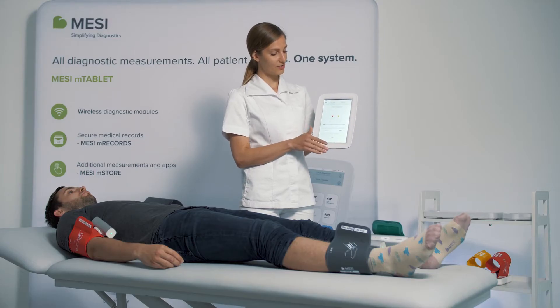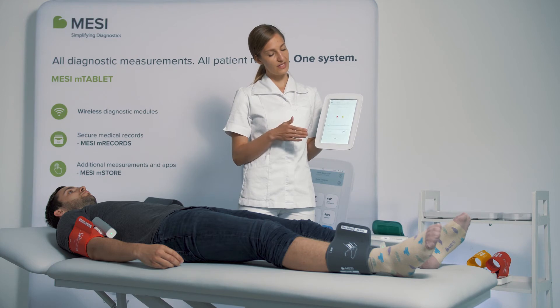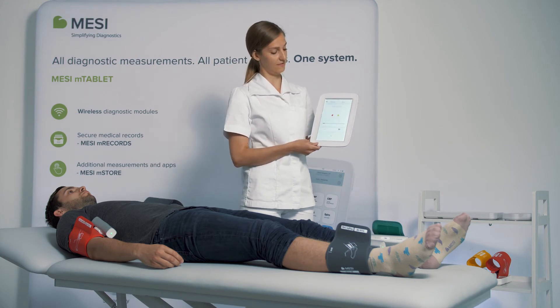After this first part of the measurement, the measurement will jump straight into a three-cuff simultaneous inflation.